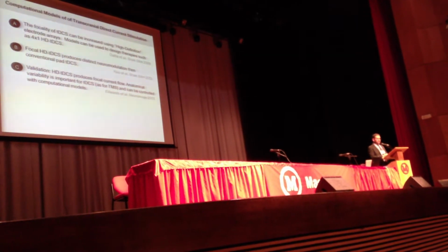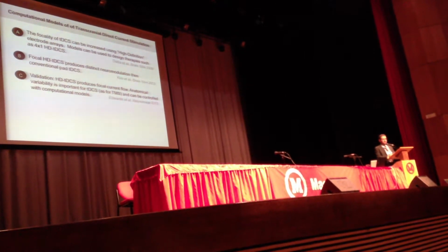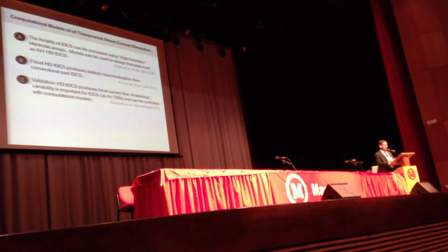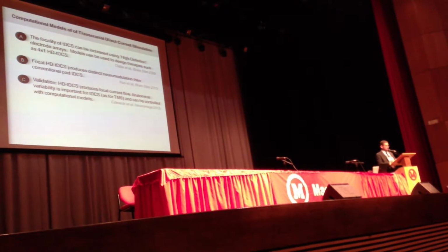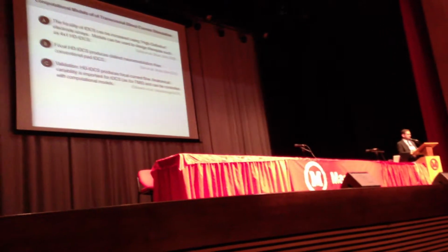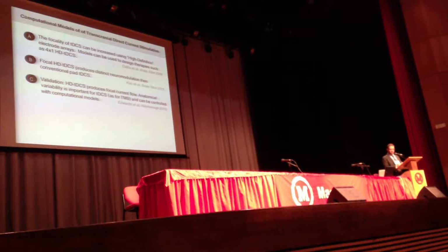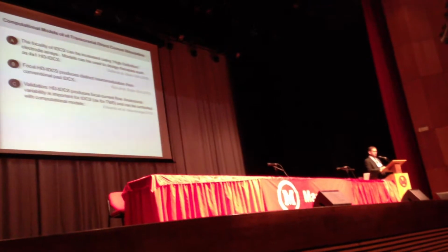So there are 2 major takeaway points from this paper. The first one is it was able to validate the focality of the 4x1 montage, not using DC current, which is being done now in other labs, but by using high voltage shocks, which sort of produce a very unequivocal muscle twitch. But the other thing this study showed is that there was a lot of inter-subject variability.